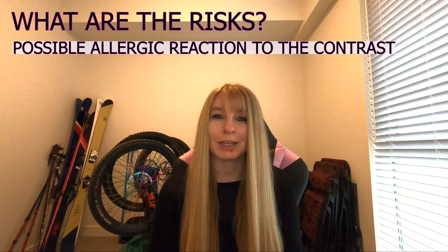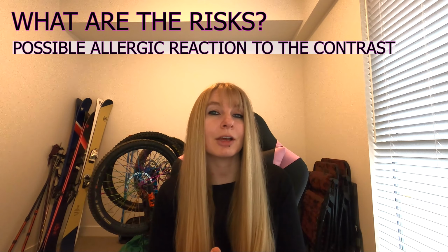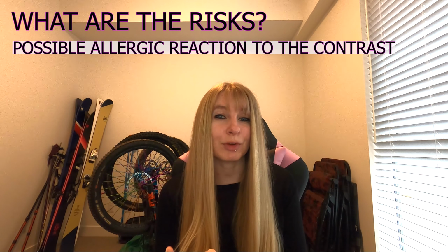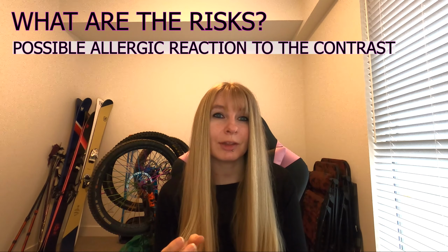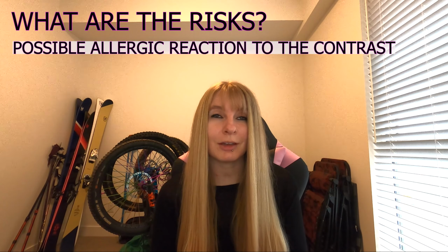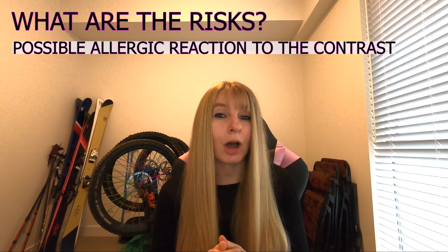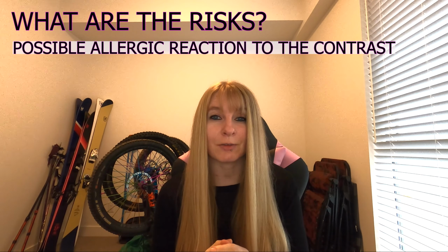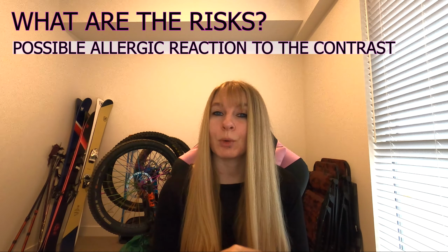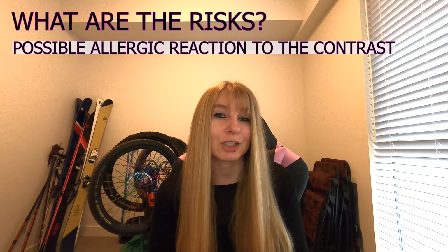Lastly, as I mentioned in the VQ scan video, there is a small chance that you may have an allergic reaction to the contrast substance. If you've ever had a bad reaction with anything like that before, then please make sure that the technician is aware of this. It's not a common thing. A lot of the time people will just get itchiness or a slight rash, but there are people out there who can really suffer a bad reaction. Generally, it is very treatable, and the staff always have the equipment on hand close by to immediately treat it if a reaction does happen.